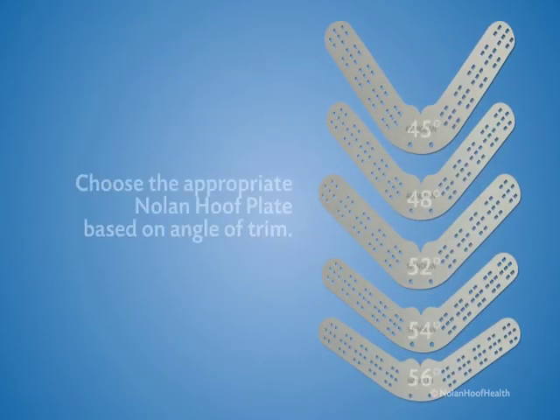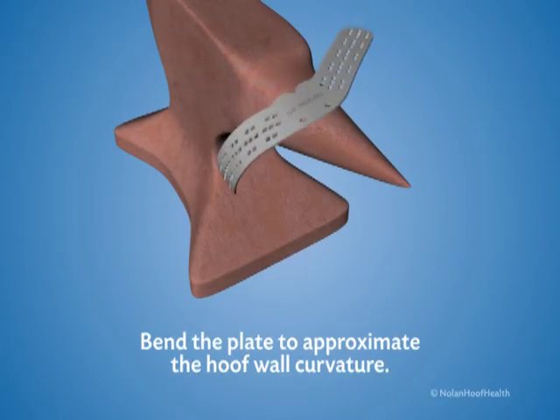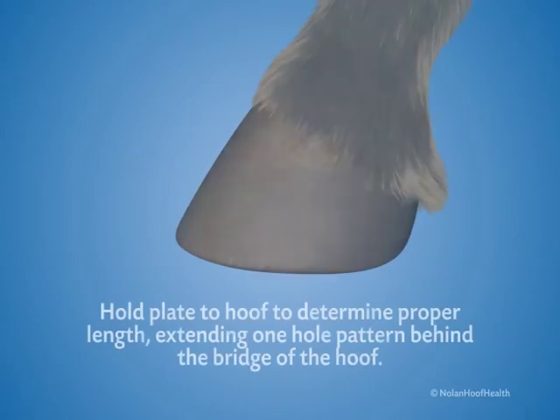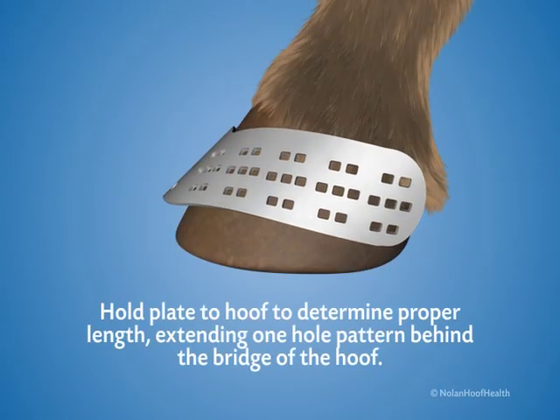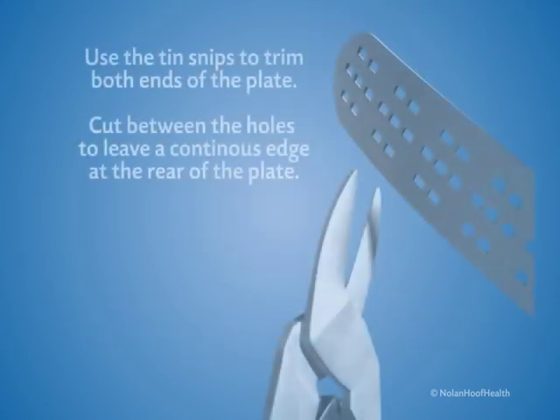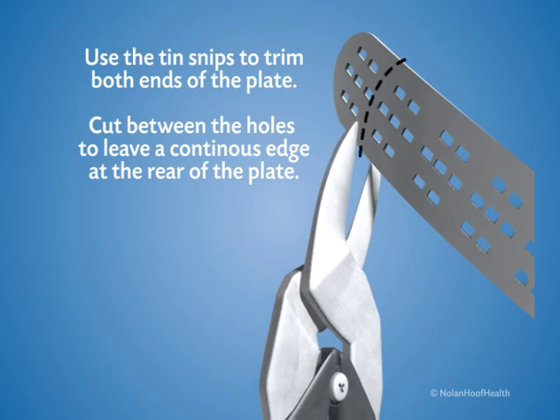Choose the appropriate Nolan hoof plate based on angle of trim. Bend the plate around the anvil to approximate the hoof wall curvature. Hold the plate up to the hoof to determine the proper length, extending one hole pattern behind the bridge of the hoof, being careful not to extend past the heel. Use tin snips to trim both ends of the plate if needed. Cut between the holes to leave a continuous edge at the rear of the plate.